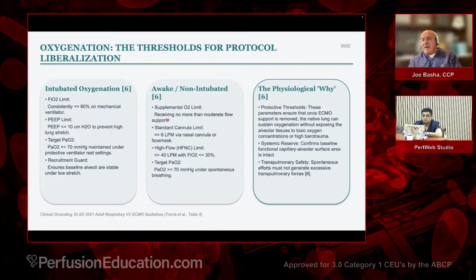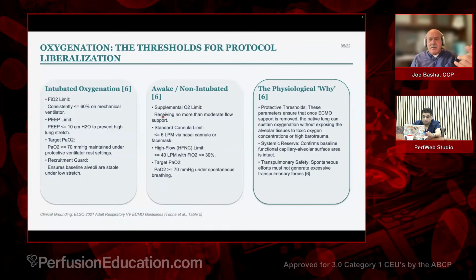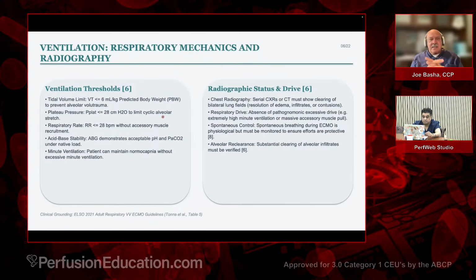Spontaneous efforts must not generate excess transpulmonary forces. You don't want these patients struggling to breathe. You don't want them drawing excessive negative pressure. These are all bad things that will cause your now weaned patient to fail. So you don't want that to happen. These guidelines are pretty straightforward, I think, if we follow those. And these are all published, and you see down below the reference for these.